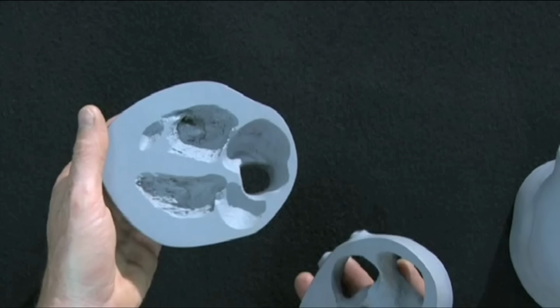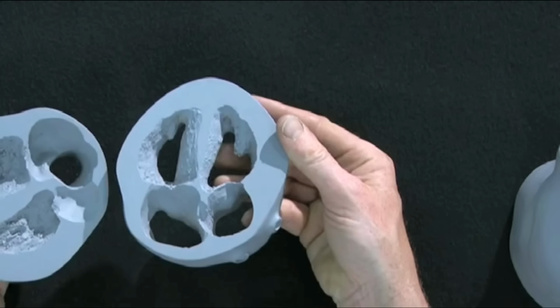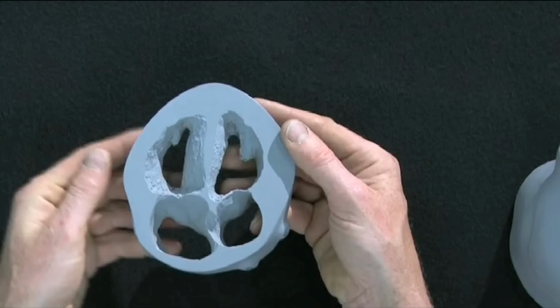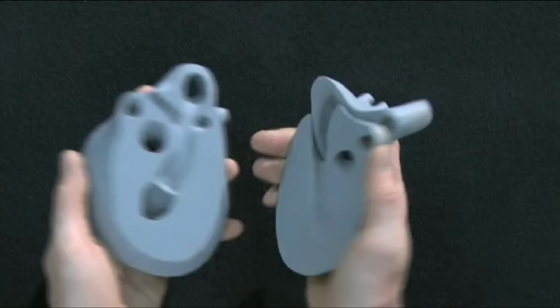And when you open it up and look at the other side of the slice, this is how it would appear with the scan beams running down the length of the interventricular septum and showing it as a much thinner structure. And this point is illustrated for each slice. The aortic outflow slices are slightly different to each other, as are the pulmonary and as are the arches.